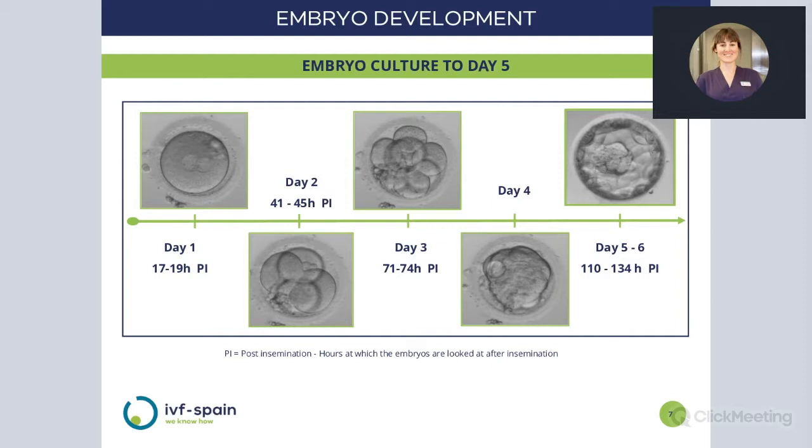Then it is surrounded by a layer of cells. This is called the trophectoderm, and it will become the future placenta. At this point, the embryo usually has around 100 to 300 cells. If you look at all of the pictures, you can also see there is a shell surrounding the embryo, and that it becomes thinner at the blastocyst stage.